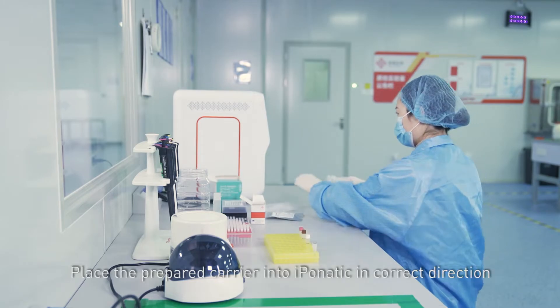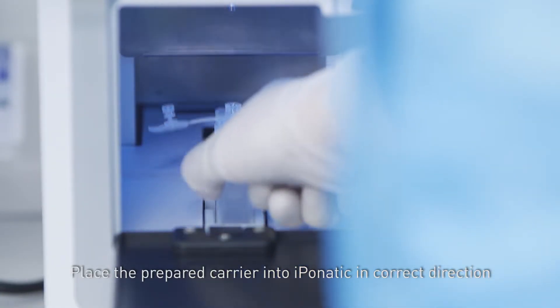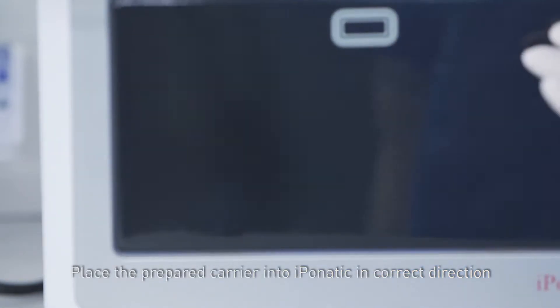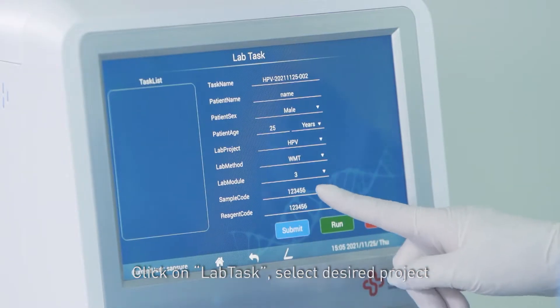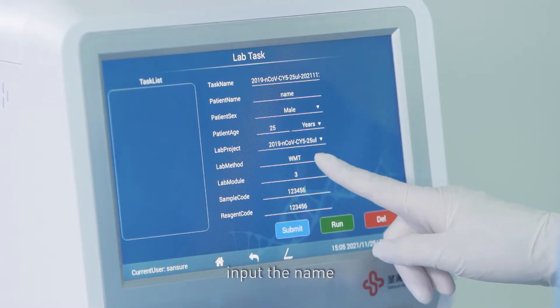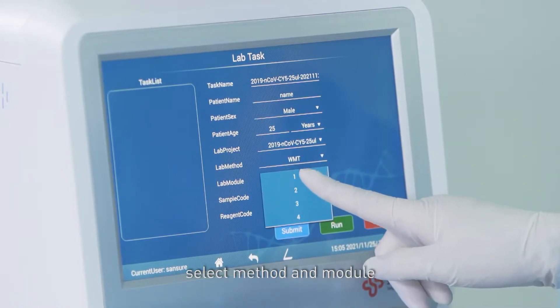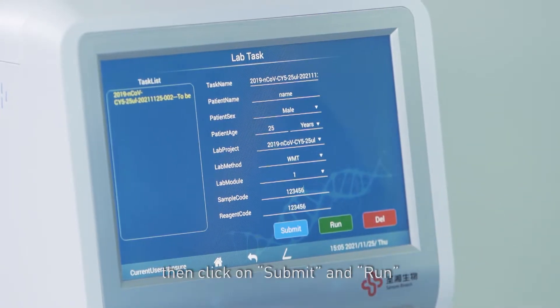Place the prepared carrier into Iponetic in the correct direction. Click on lab task, select desired project, input name, select method and module. Then click on submit and run.